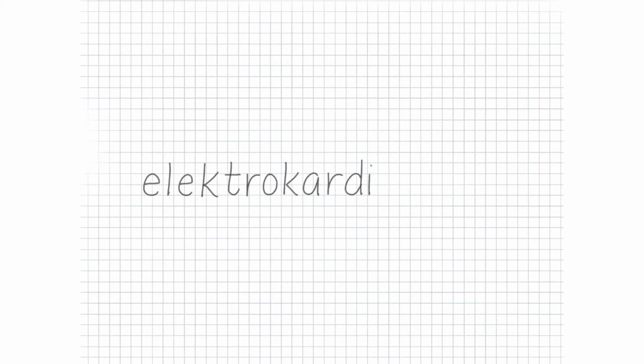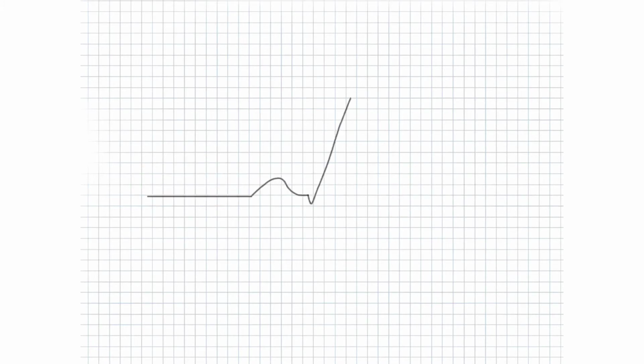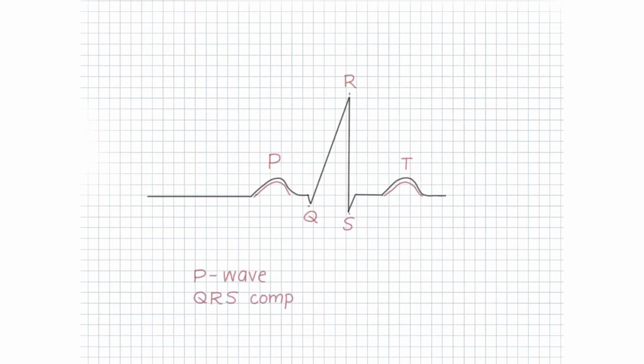So EKG stands for electrocardiogram, and I'm going to spell it the German way because that's where the term EKG comes from. They spell it with a K. So EKG, but in English it would be ECG. If I draw out the typical wavelength of an EKG, we can label the different sections: P, Q, R, S, and T. P is considered a wave. QRS, that big spike, is considered the QRS complex, and then there's a T wave. There may be other waves as well, but we'll focus on the most commonly seen. Then you can look at different segments, like from T to P, P to R, and S to T.